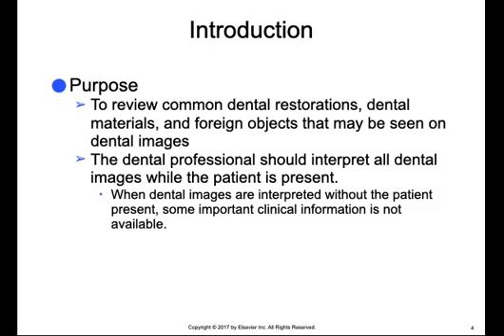The dental professional should interpret all the dental images while the patient is present, because if questions arise as to what is seen on the dental image concerning dental restorations or any other foreign objects that we talked about, the clinical examination of the patient can be done to obtain additional information or to verify what is seen. When dental images are interpreted without the patient present, some important clinical information may not be available.